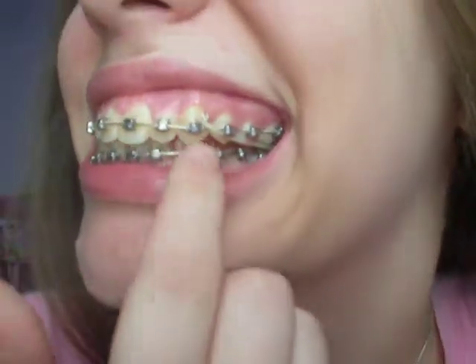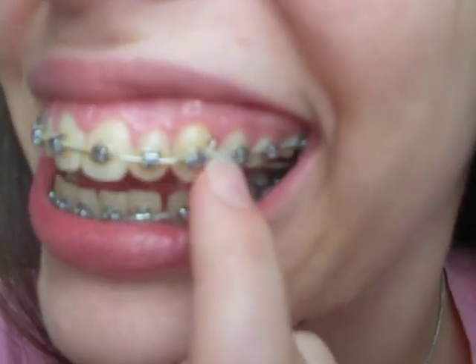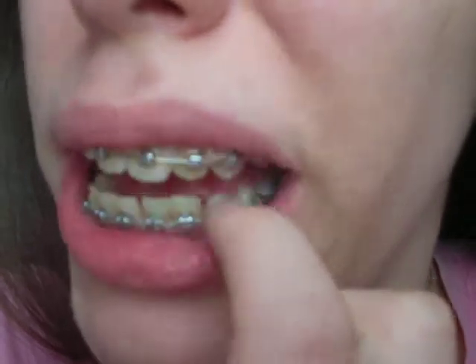Tiffany also asked, how do I attach the elastic bands that go from the back hooks to these front ones? I think I did cover that in a previous vlog, but I'll show you again if you insist, which is always a problem because it's actually quite hard to do even when you're looking in a mirror. So when you're looking in the camera lens with no way of seeing yourself, it can be quite troublesome. So you can see the elastic hooks over that front hook there and goes back to one right at the very back.